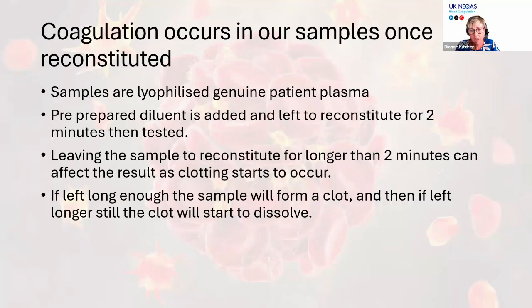The other thing that I'm concerned about with this centre was whether they were following the timings as well. So I said earlier that we leave it to reconstitute for 2 minutes, and then you test it as a patient sample. Once that liquid has been added, a clot is starting to form, and if you leave it long enough, you will get a solid clot, and if you leave it longer still, that clot will dissolve as part of the lysis process.